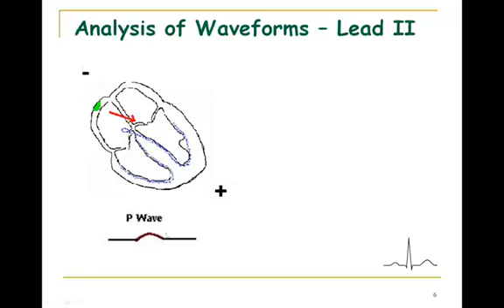If you notice the P wave, the P wave represents depolarization of the atria. The average vector that you're seeing of current flow of the atria is pointing a little bit to the left. The reason why is the right atria depolarizes a little bit before the left atria, because remember, everything starts up here in the SA node, and then the impulse has to go over to the left atria using those interatrial bands. So this is going to depolarize a little bit before the left. So the left side takes a little bit longer to depolarize. On average then, the average direction of current flow is going to be moved a little bit to the left.